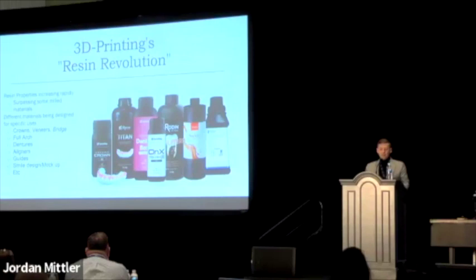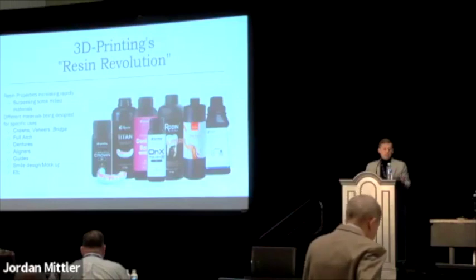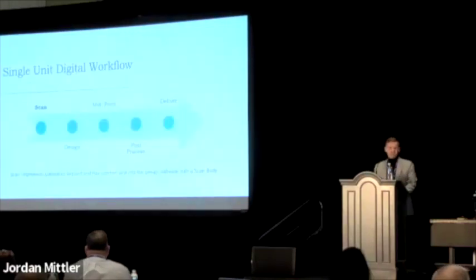In the last year or 2, I think we're entering what I would call a resin revolution. And just recently, some resins have surpassed the qualities of their milled counterparts when we're talking about long-term provisionals. And there's just such a wide variety of applications for 3D printing and resins, right? So there are resins for all sorts of restorations, and each one of them is expanding greatly.